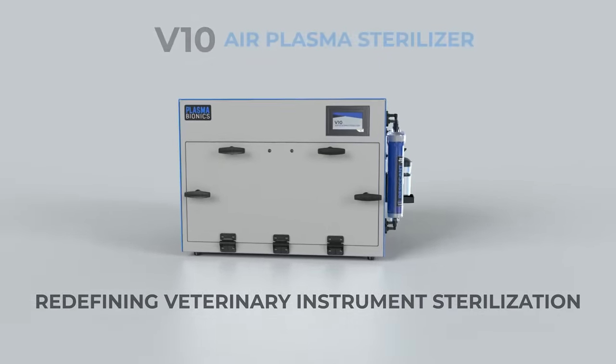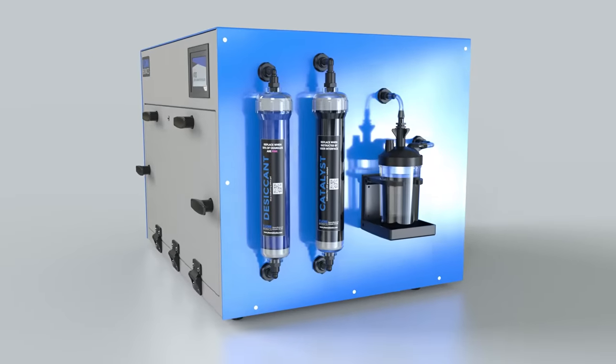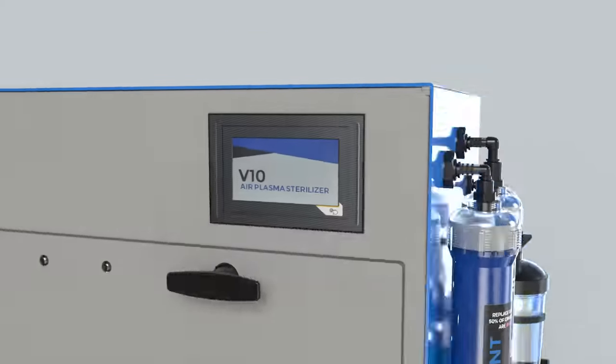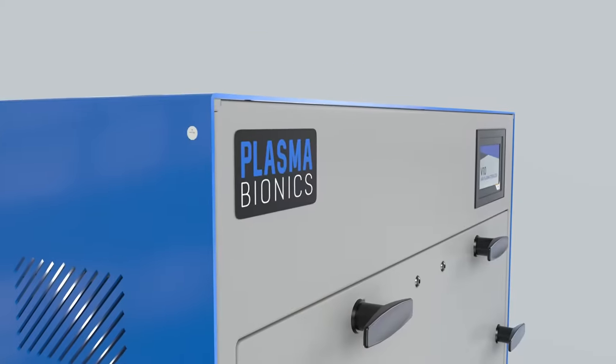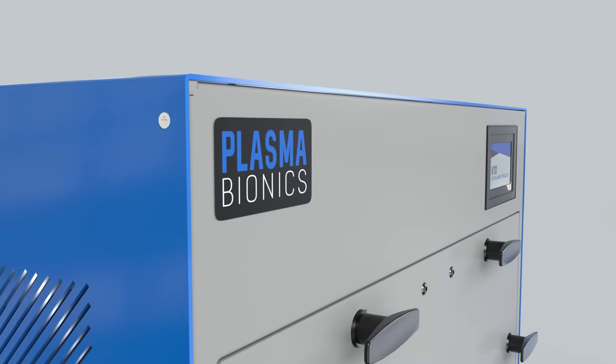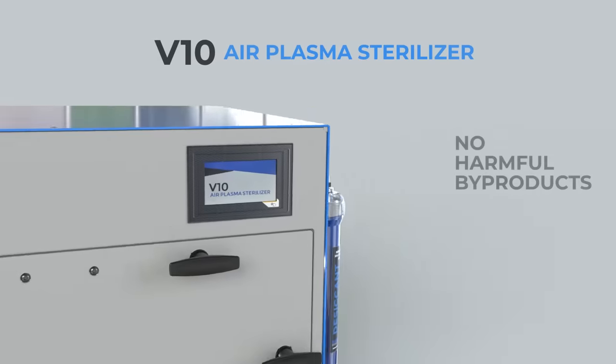Plasma Bionics is redefining veterinary instrument sterilization with the V10 Air Plasma Sterilizer. Thanks to our innovative air plasma sterilization process, veterinary practices of all sizes can now safely sterilize complex instruments while reducing costs and increasing productivity.